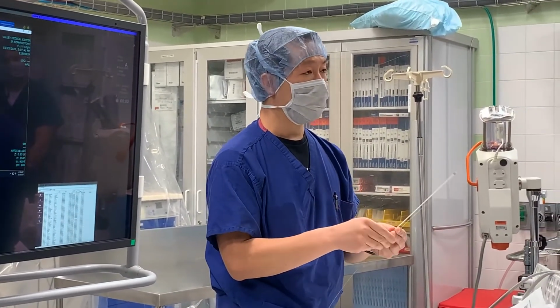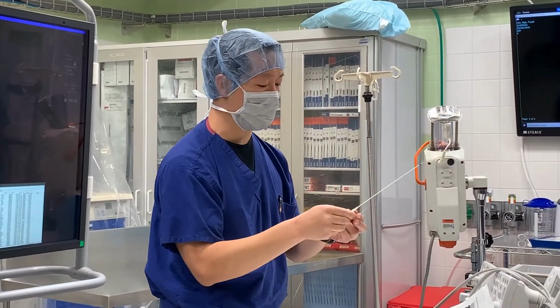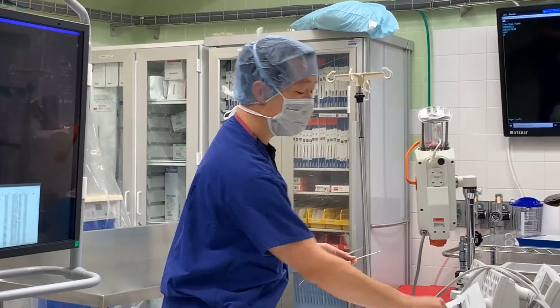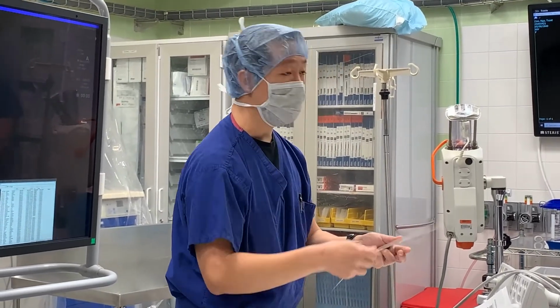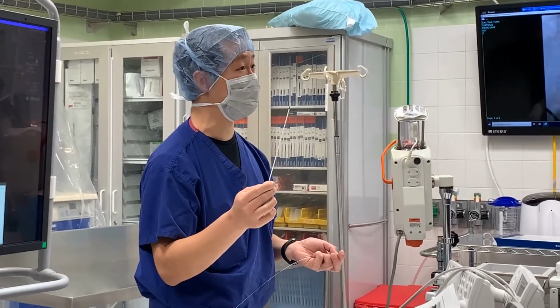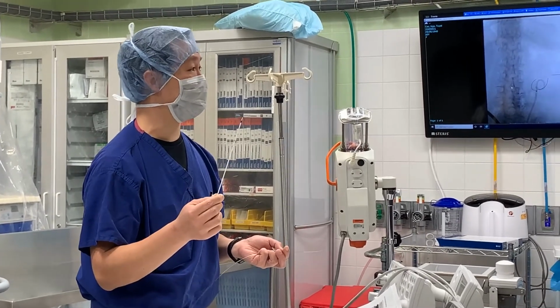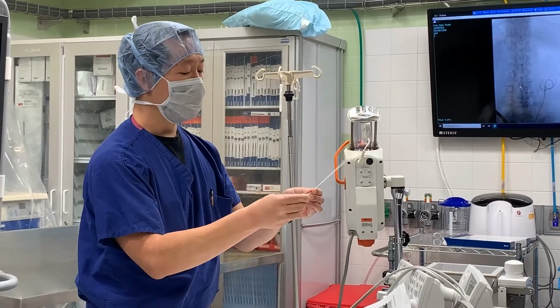This, the only purpose of this, what French is this? 6. Good. Okay, so we said we want to poke it first with an 18 gauge needle, which is less traumatic. 6 French is pretty traumatic. If I hit an artery, that's a 6 French hole. You guys know what 6 French holes do in the femoral artery, right? A 6 French hole in the renal artery does exactly the same thing.